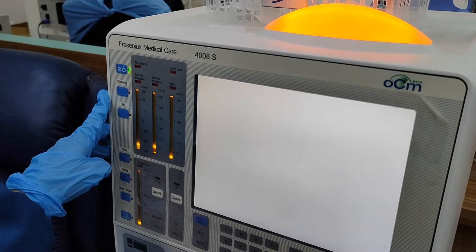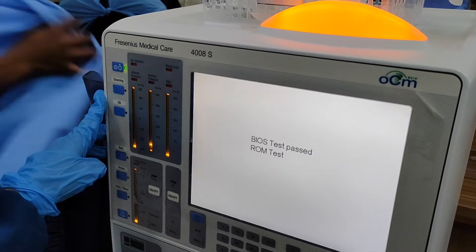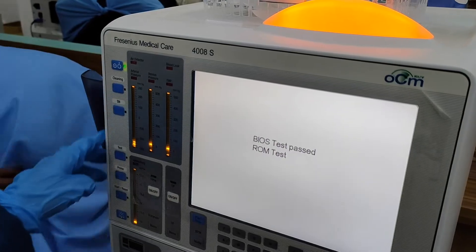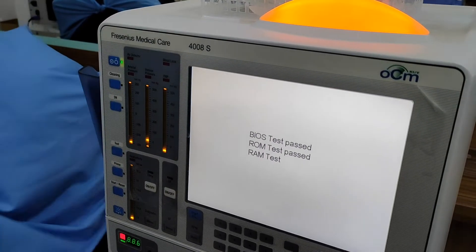Turn on the HD machine. The power button of Fresenius 4008S is located on the upper left corner.